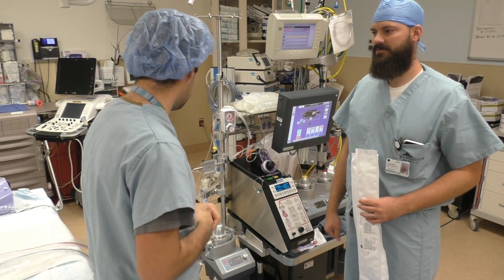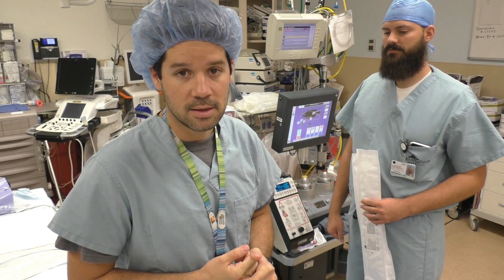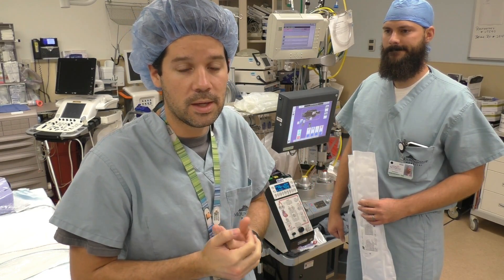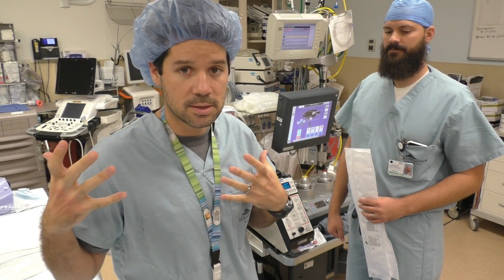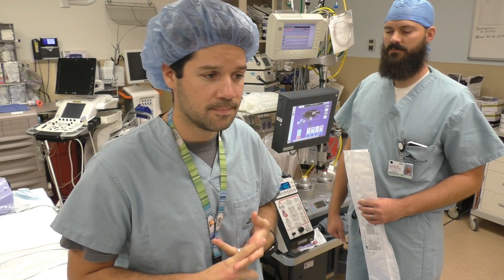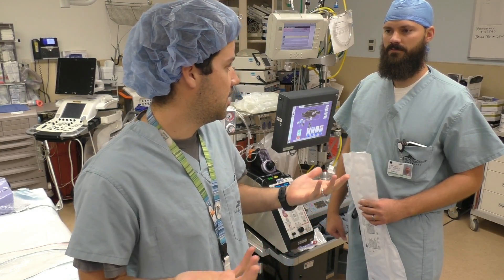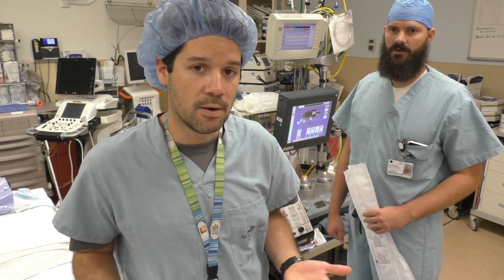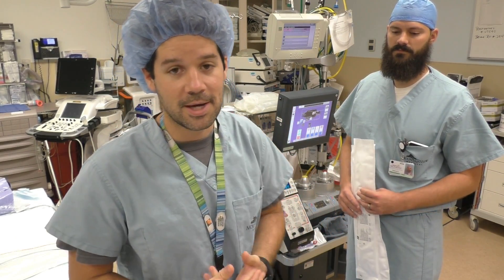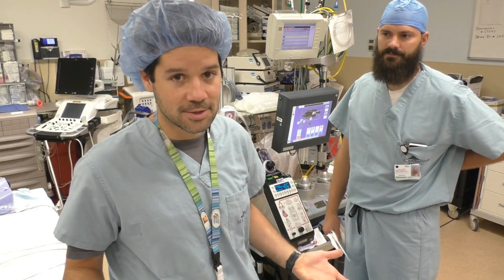To simplify this machine, basically it's put in place to oxygenate the blood from the heart. When we go on bypass and when we need to open up the heart — the surgeon needs to maybe replace a valve or fix a hole in the heart — we have to stop the heart and basically arrest the patient to work on the heart. He's here and this machine is here to ensure that the patient doesn't actually die. That's essentially what it is.